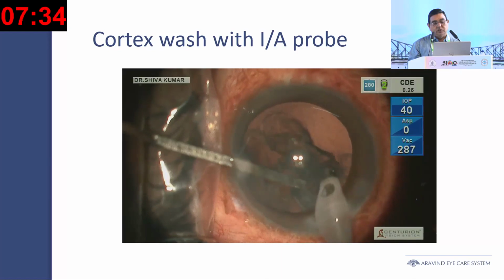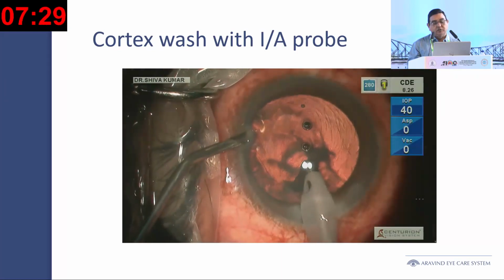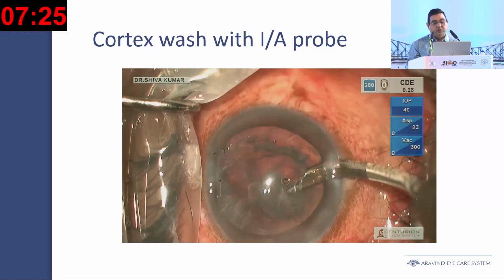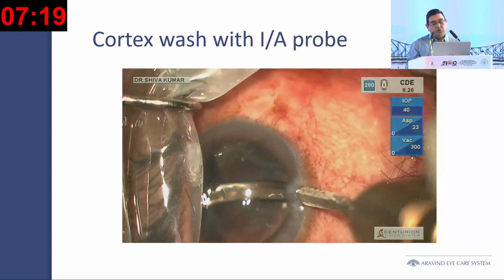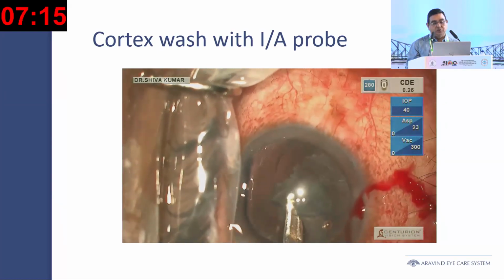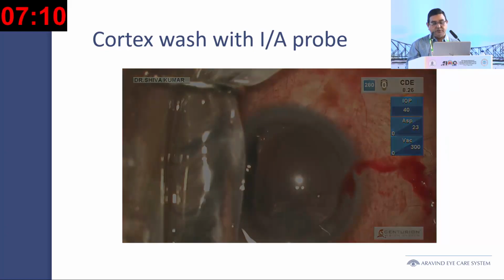Now I see the line, so I fill the chamber with viscoelastic, and I am more comfortable making a new side port and using a dry Simcoe cortical aspiration to take the rest of it. This ensures that I remove the cortex without breaking the anterior vitreous face.